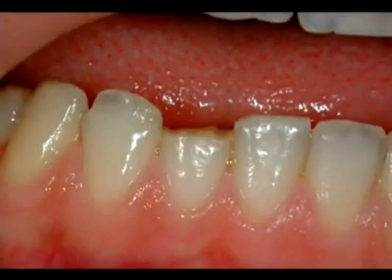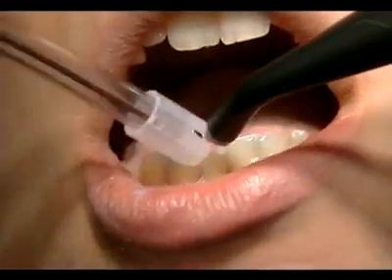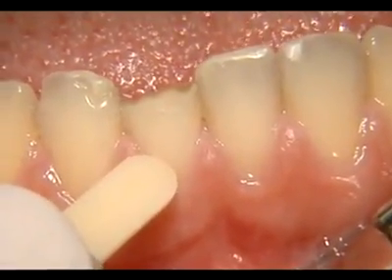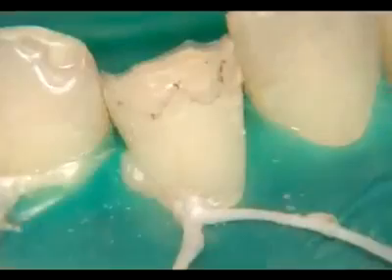Preoperative situation. A 24-year-old patient with a fractured central incisor in the right lower jaw. First, the teeth are cleaned with a polishing paste. The dentin shade is determined in the region of the cervical to the second third of the incisor to be restored. In addition, the enamel shade is determined on the basis of the upper, for example, incisal third.